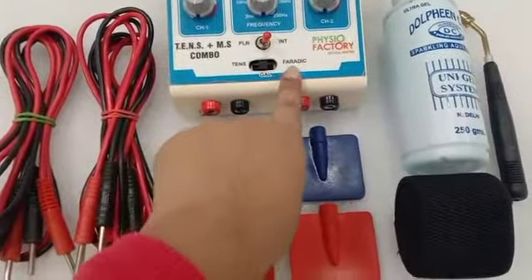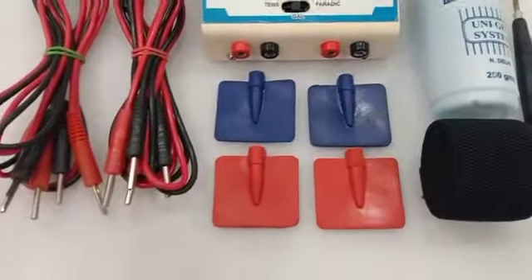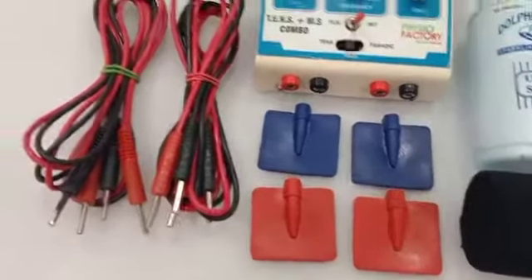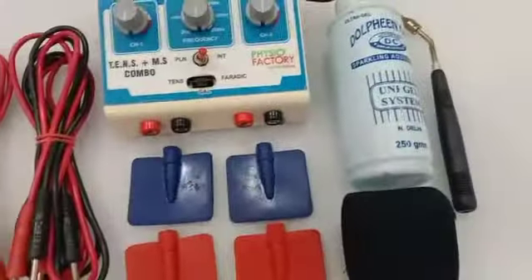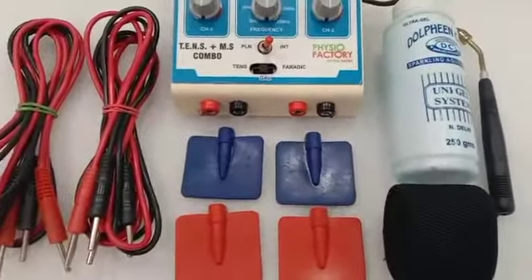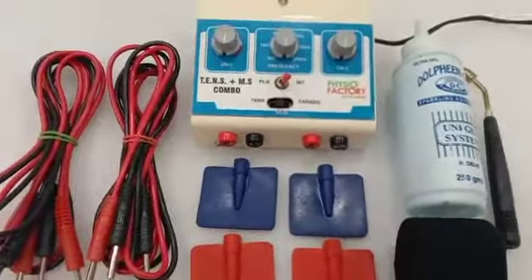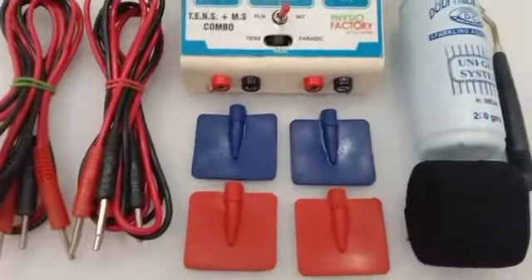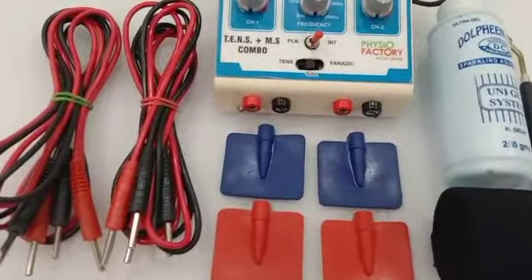You can use TENS, galvanic, and faradic. This is a four-pole machine. These are the pads which you will get with the machine, along with one wire, one gel bottle, one pen electrode, one velcro, and one bag. There is a one-year replacement warranty available on this machine.